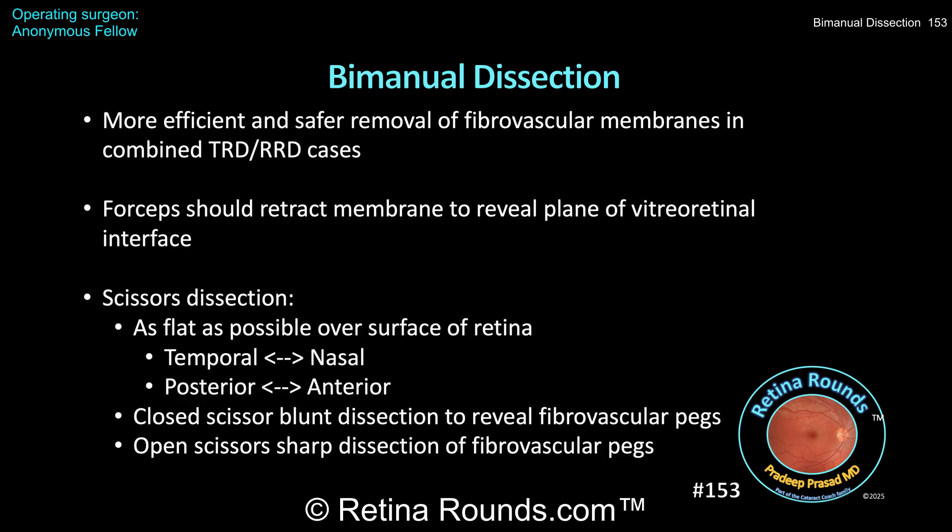The scissors in the other hand should be positioned at an angle as flat as possible over the retinal surface. Given the posterior curvature of the globe, curved horizontal scissors are ideal to dissect at the vitreo-retinal interface without creating iatrogenic retinal breaks. As seen in this case, it can be safer and more efficient to dissect in a nasal-to-temporal or temporal-to-nasal direction, especially in the superior retina. In other instances, an anterior-to-posterior or posterior-to-anterior approach may be preferred. Generally, dissection in an anterior-to-posterior direction may be safer in the superior retina.